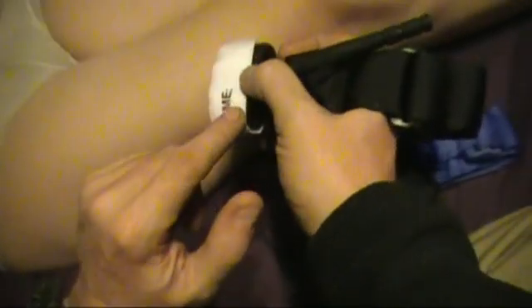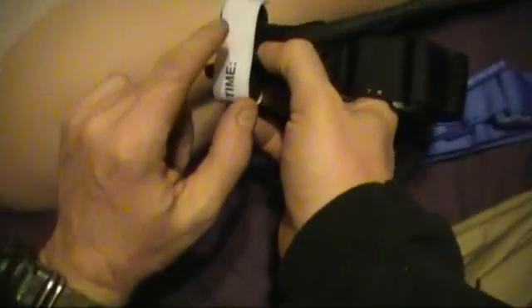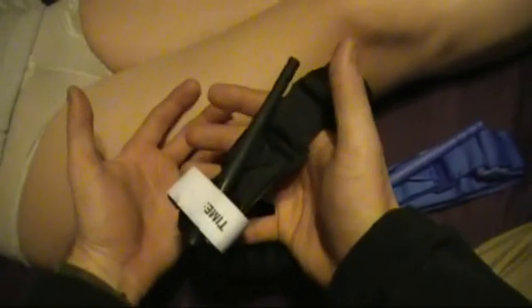Now, the civilians are really hardcore about writing the time on it. And military as well, but with civilian protocols we're definitely sticklers on time. If you have a Sharpie or something, write down the time that you put it on there. This way the surgeons, when you get them, have an idea of how long this tourniquet has been applied to the limb, and then they can take other measures to prevent more damage.